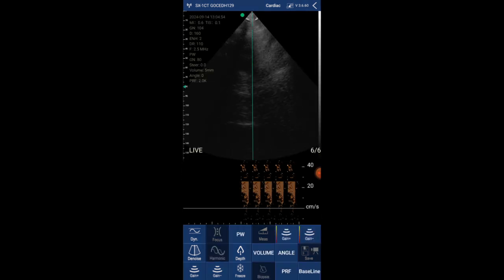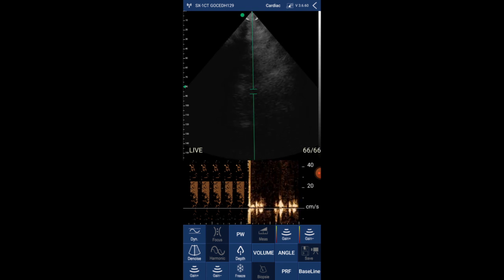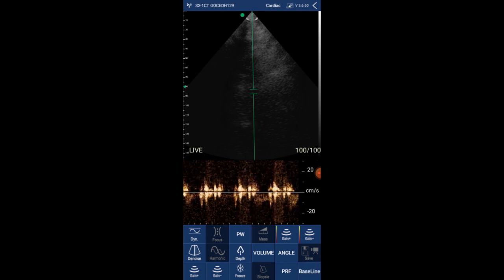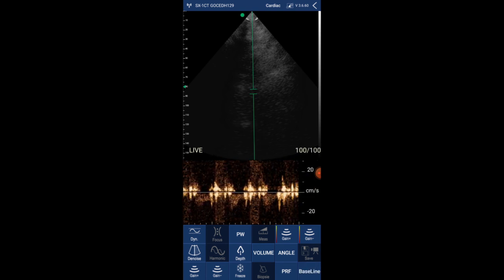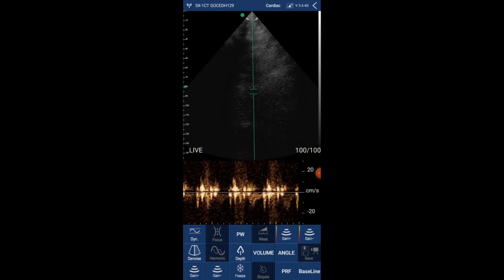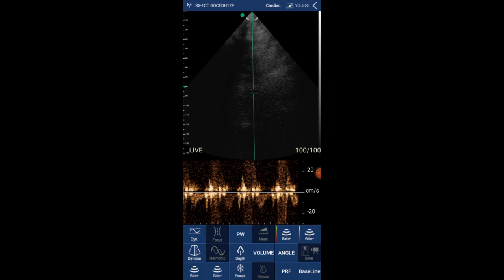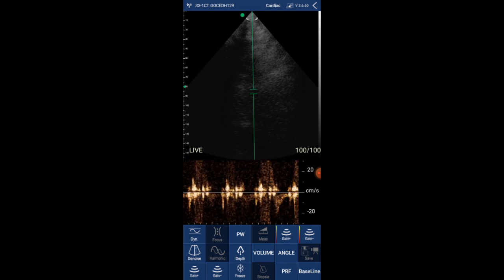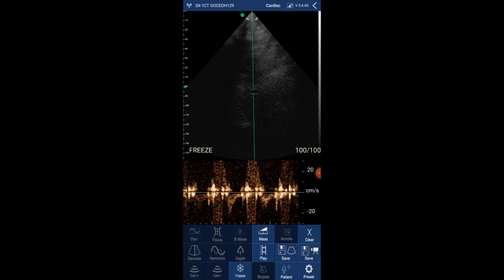You can also freeze and save every picture and video. Now have a look at the pulse wave Doppler — what do you think about this pulse wave Doppler of the descending aorta? There is definitely a learning curve, but you can do so much with this device and this app, even sending the videos and pictures you took.